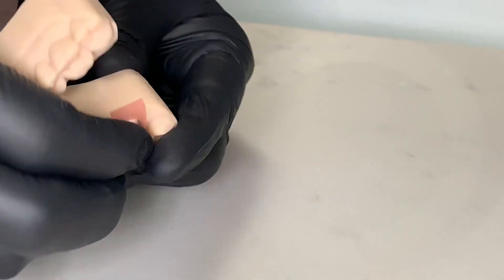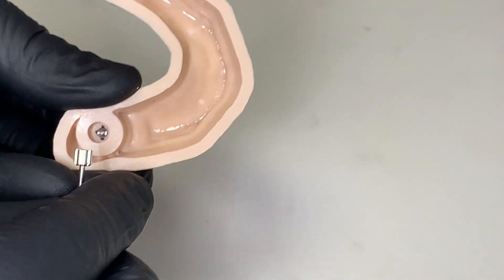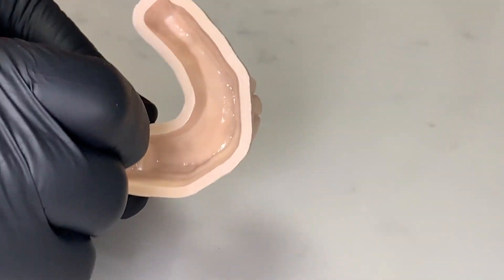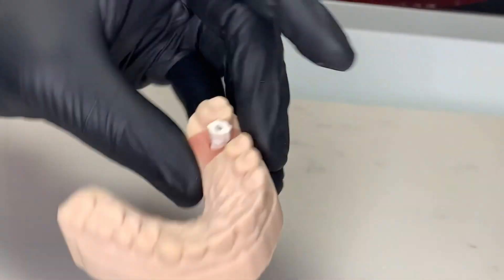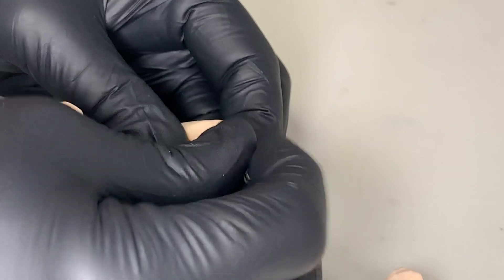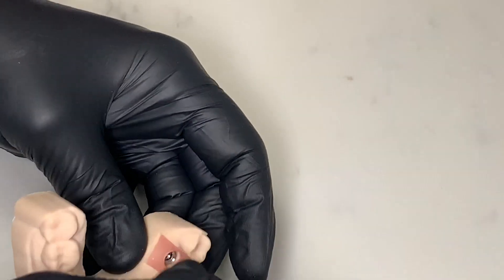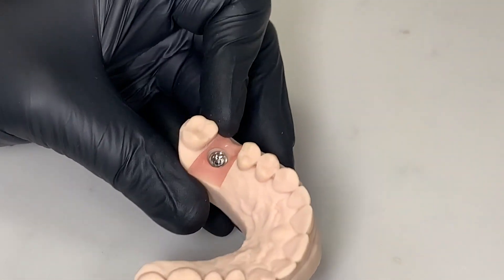I've gone ahead and put the scan body on this just to serve as a handle. We can go ahead and put this in and just rotate it until it goes down all the way. Holding it down, I'm going to take this part — it's just a little set screw that screws the whole thing in. And so now we have our analog model with the scan body. I'm going to remove the scan body — and voilà, we've got an implant analog model.